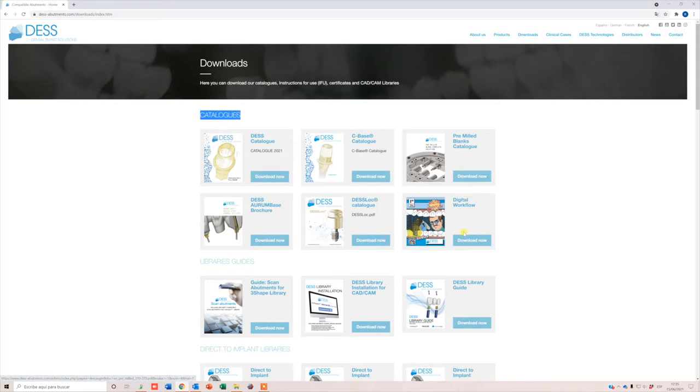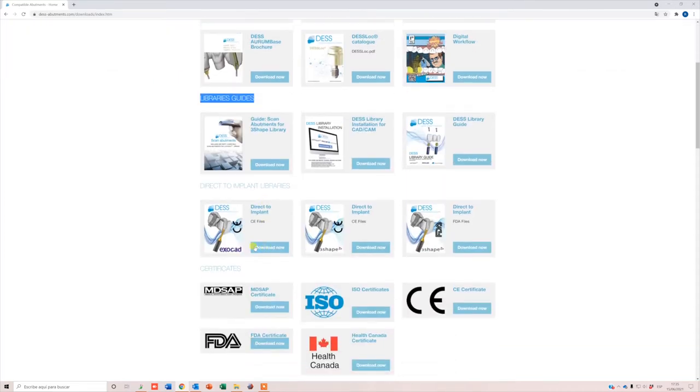Catalogs: Here you'll find all the DES catalogs. Library Guide: A quick reference guide to all the files. Direct to Implant Libraries.